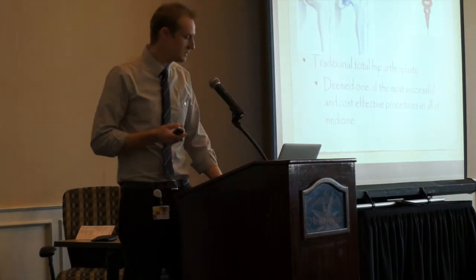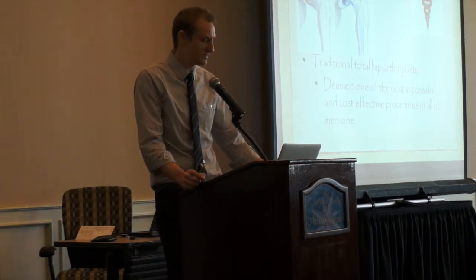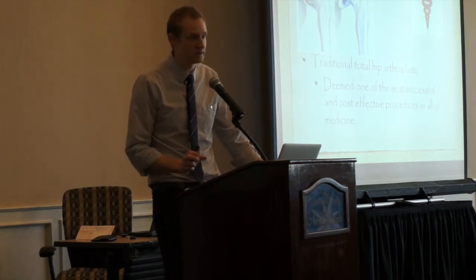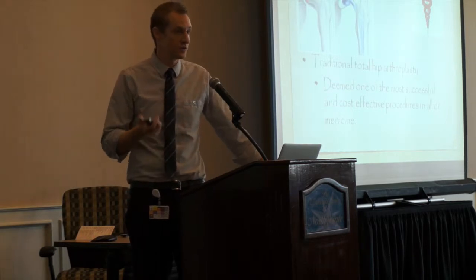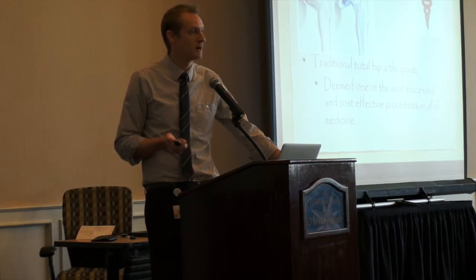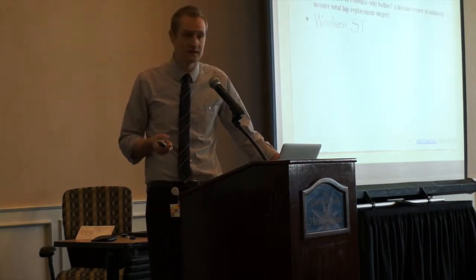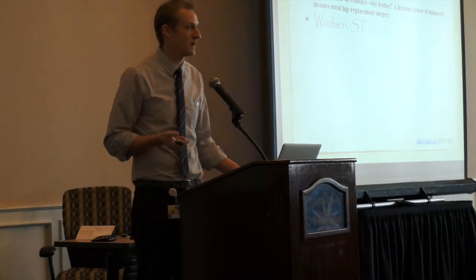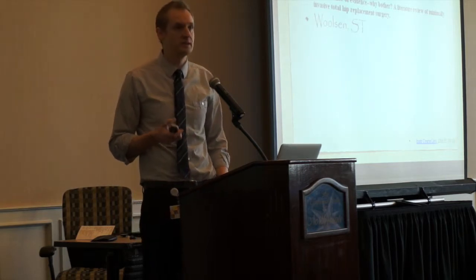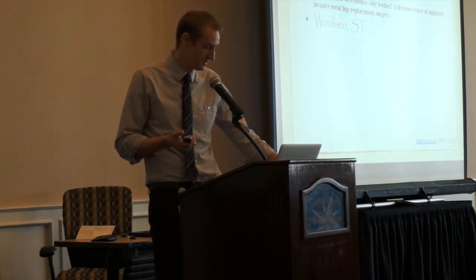So, talking about traditional total hips, it is deemed as one of the most successful and cost-effective procedures in all of medicine. And I'm not just talking about the anterior approach, I'm talking about the traditional approaches, the posterior, the lateral, anterolateral, which is obviously much more common than performing total hips through the anterior approach. And that kind of begs the question then, why bother? Why are we doing this? Why change something that is so successful that it's actually been stated by Medicare Services to be one of the most successful procedures in all of medicine?